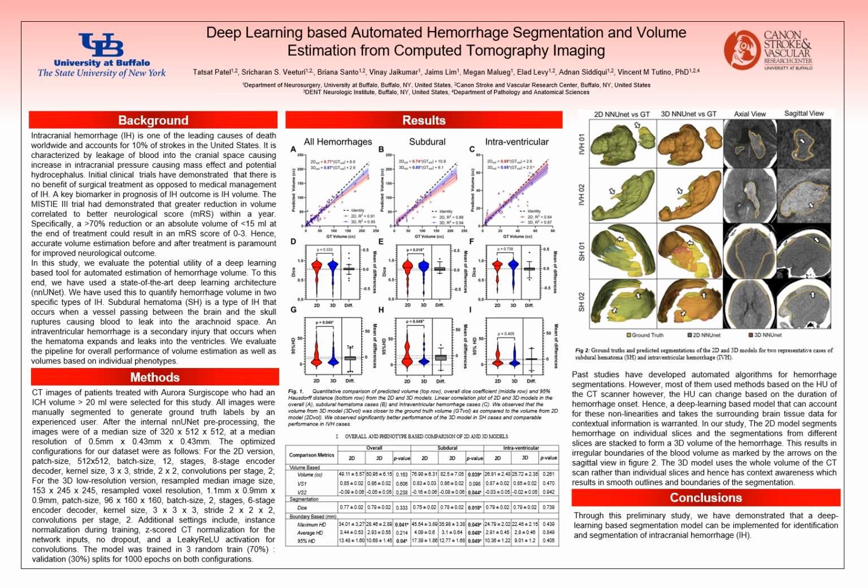But studies have shown that this does not correlate very well with the neurological outcomes, potentially because this is a very crude way of estimation. And in cases of intracranial hemorrhage, the accurate estimation of volume is paramount.